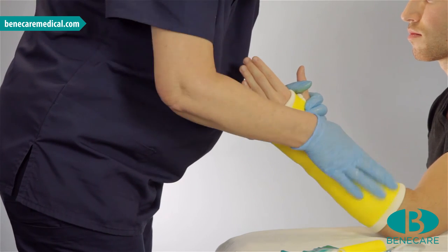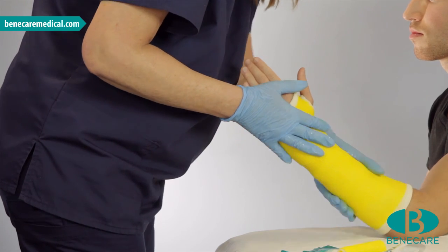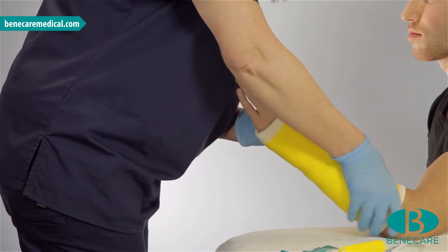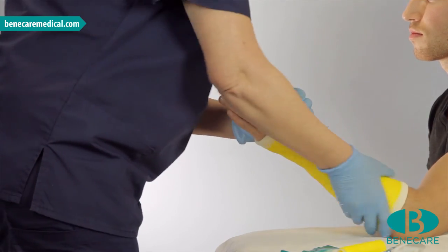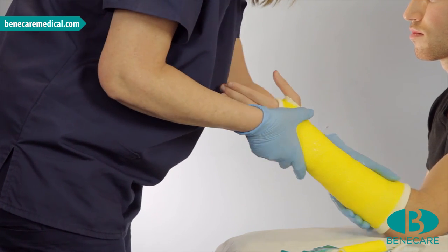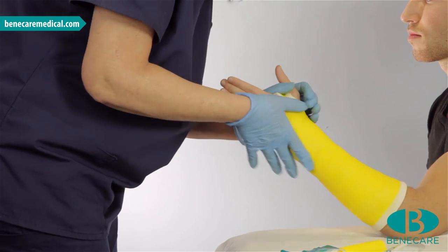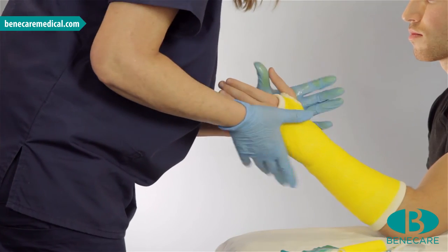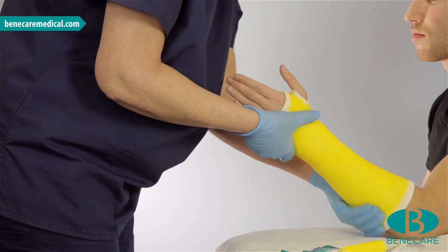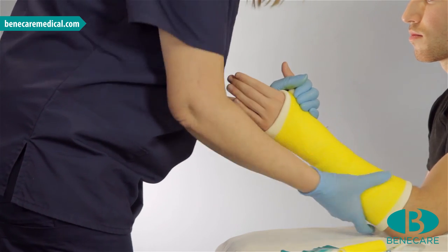You need to mould with one hand and hold with the other. I am using my thenar eminence against the patient's, and this will ensure an excellent fit around the hand, as this material holds the mould exceptionally well — it will not spring back. The set time can be varied between 4 and 7 minutes depending on the dip technique. The ideal temperature for the water is 22 degrees. At approximately 5 minutes, the cast will reach the green stage of the setting process. Now it can be rested on a pillow or put in a sling. It will reach functional strength at 30 minutes.